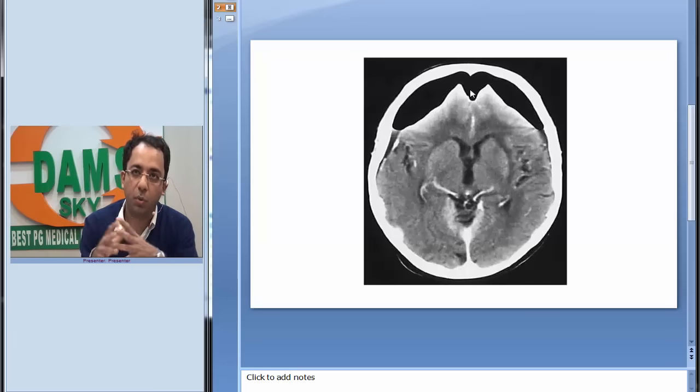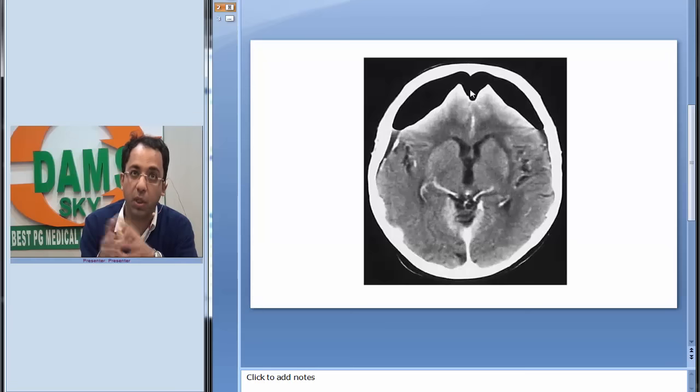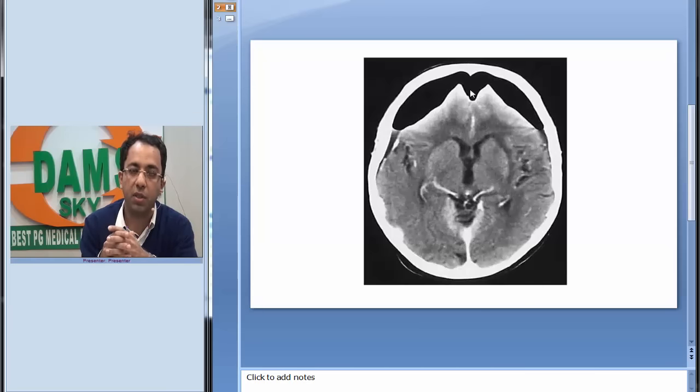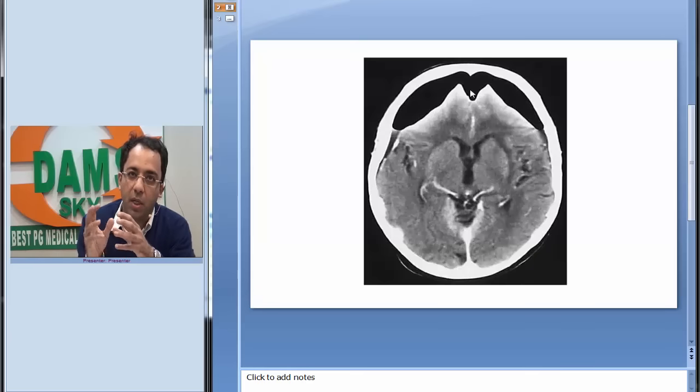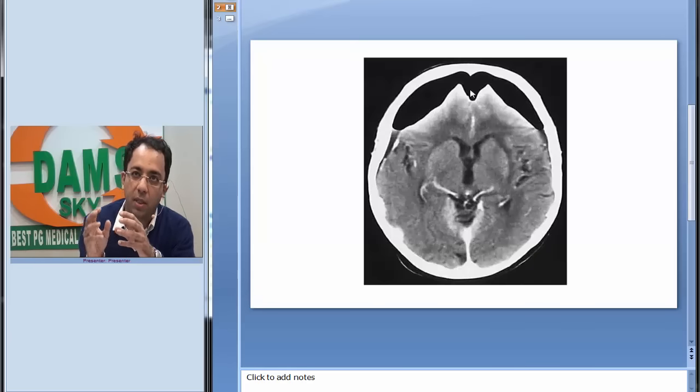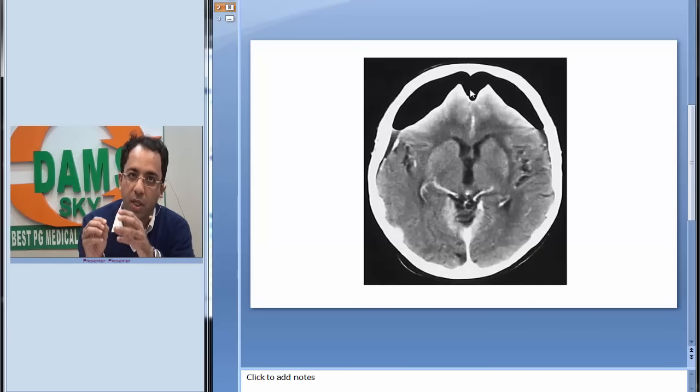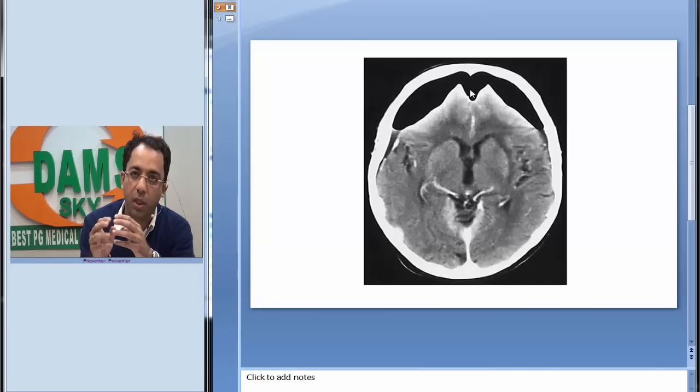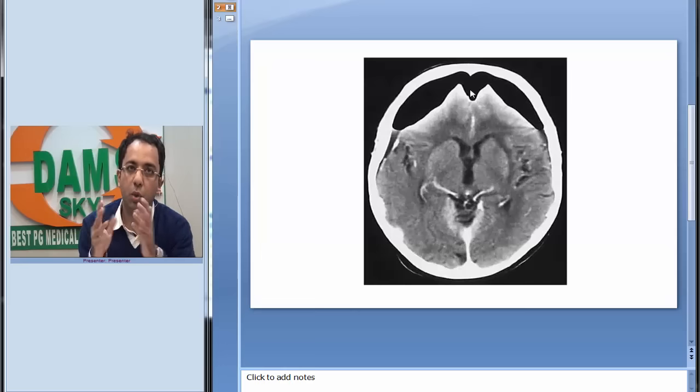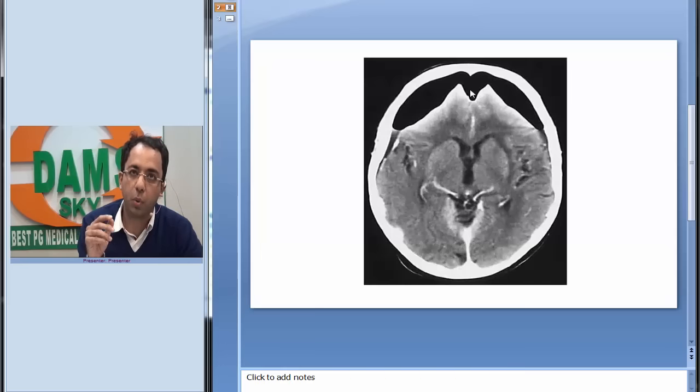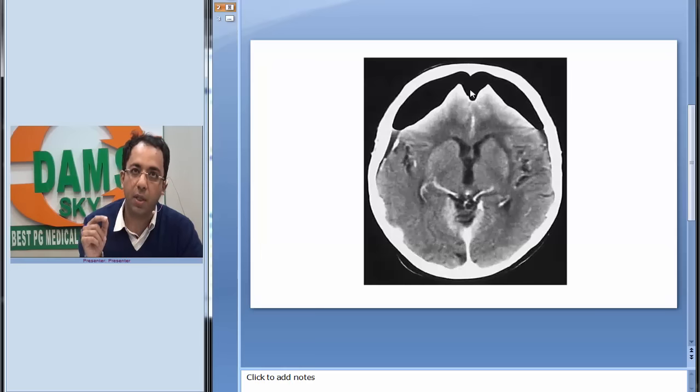It's not a normal pneumocephalus. We would want to intervene in such a patient because this indicates tension pneumocephalus. It is telling us that the pressure of pneumocephalus is at least more than the surface tension of the CSF which would have held the two frontal lobes together. In this patient they are separated.